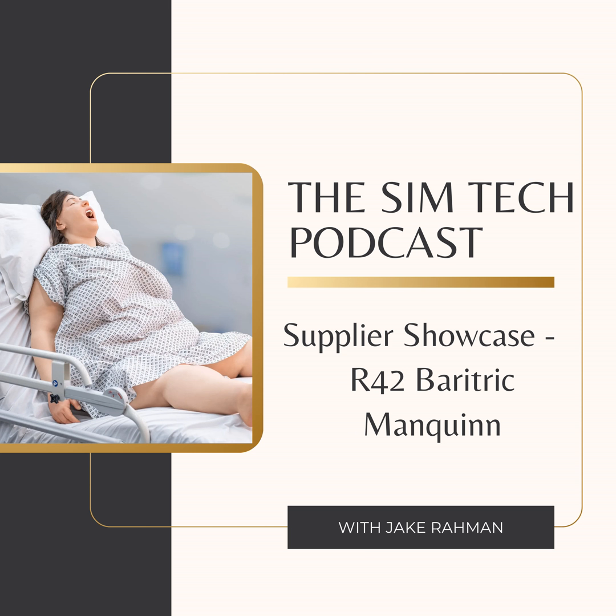You know. Well, I hate to break it to you, Craig, but you haven't got a female mannequin at all. So Sim Mum is not female. No. Sim Mum is a male ALS mannequin from Laerdal with a female face on it, and that's why the old Sim Mum, the original one, has that male jawline. Because it was an ALS mannequin that was put together with the prompt mannequin from Limbs and Things, and that's what created Sim Mum. So it was a male mannequin turned female.